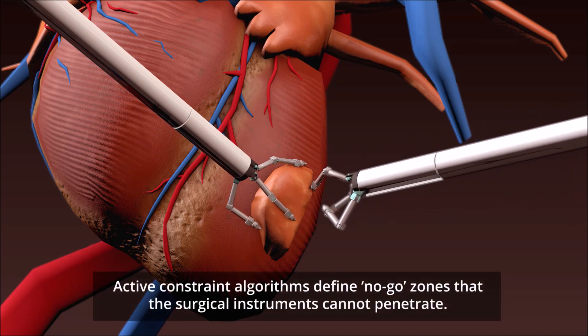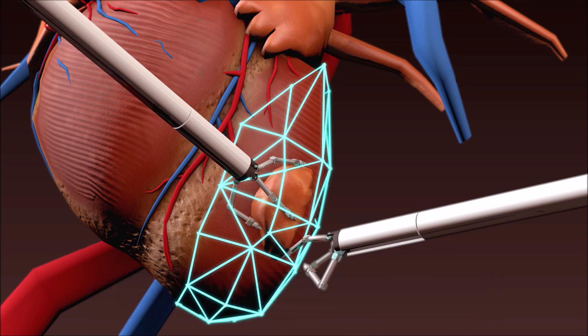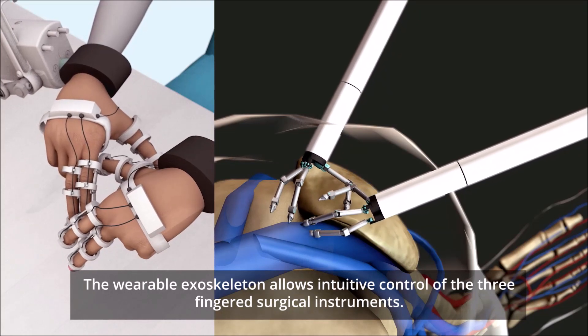Active constraint algorithms define no-go zones that the surgical instruments cannot penetrate. The wearable exoskeleton allows intuitive control of the three-fingered surgical instruments.